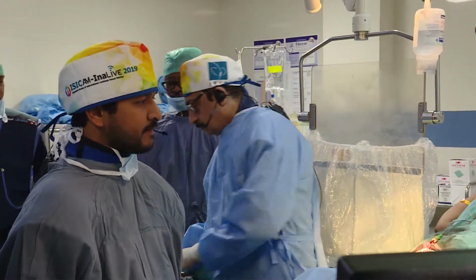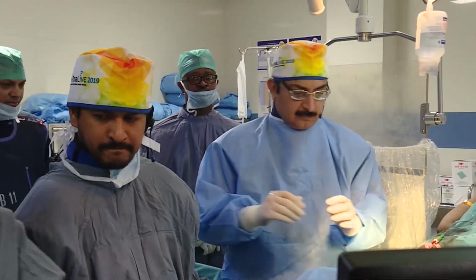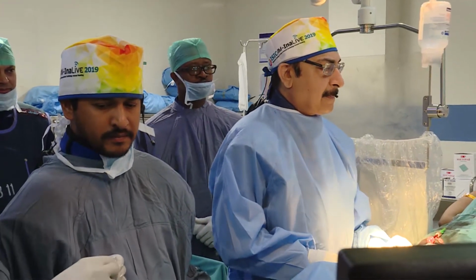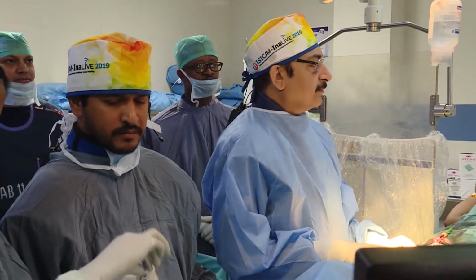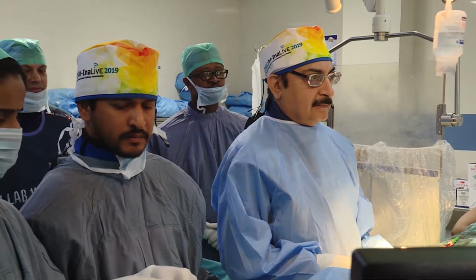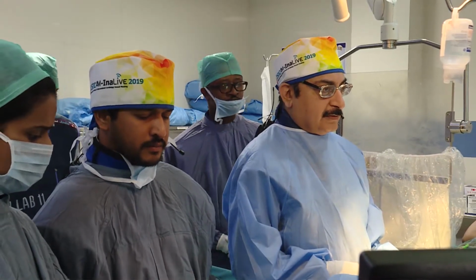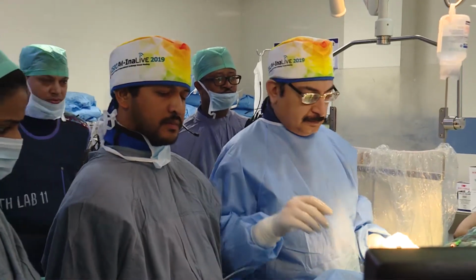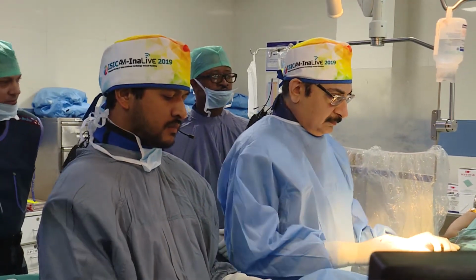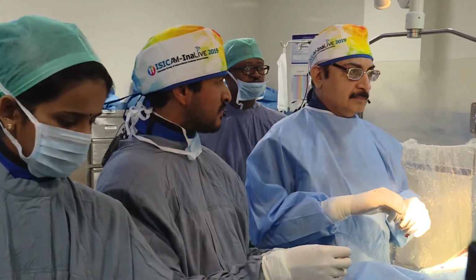Okay, any other comments from our esteemed panel, if they would like to comment on the procedure? Dr. Khanna, this is May. From the spider view, we see that the first diagonal is very tight, ostial. What is your planned technique for stent implantation for the ostial first diagonal?